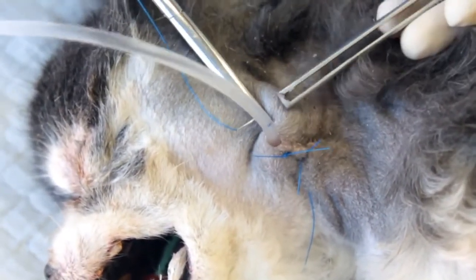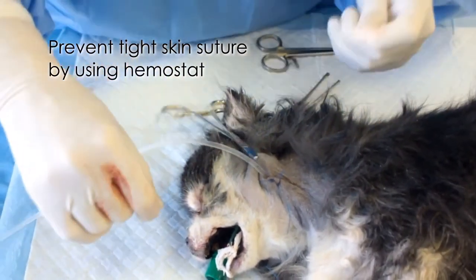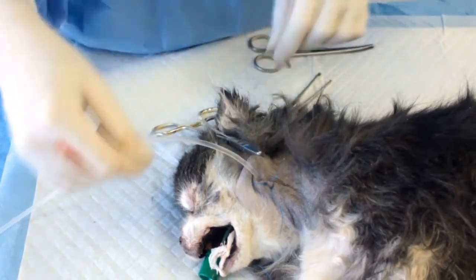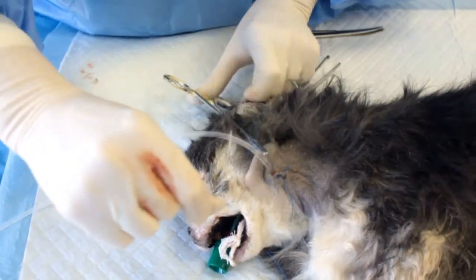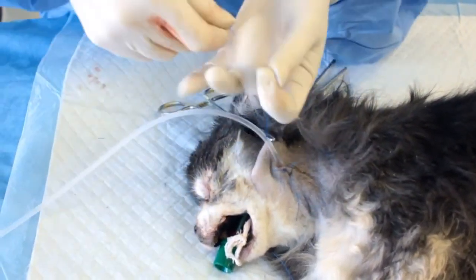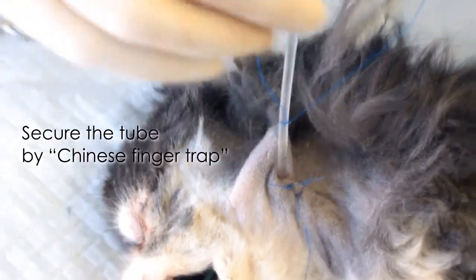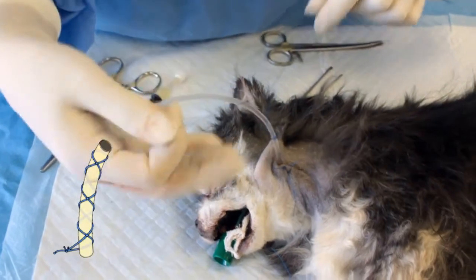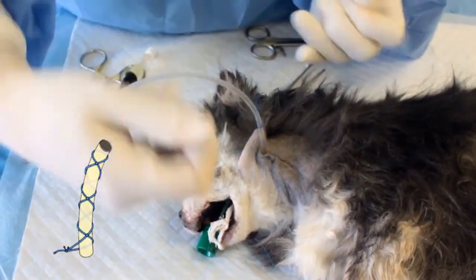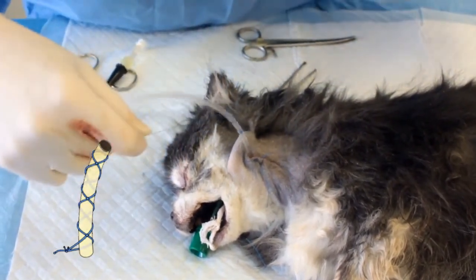As the first anchoring suture, that she's about to do. Alright. Over. With under, knot at the top, right. Flip it under, cross it, no knots at the bottom, just on top.